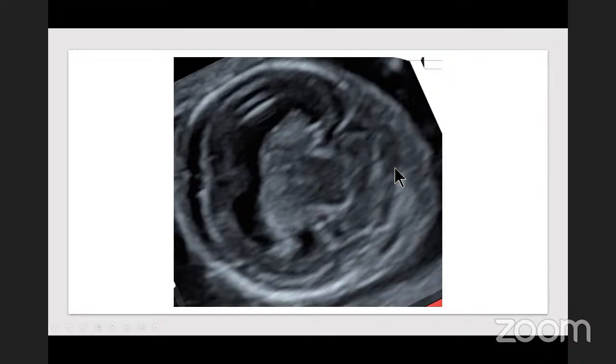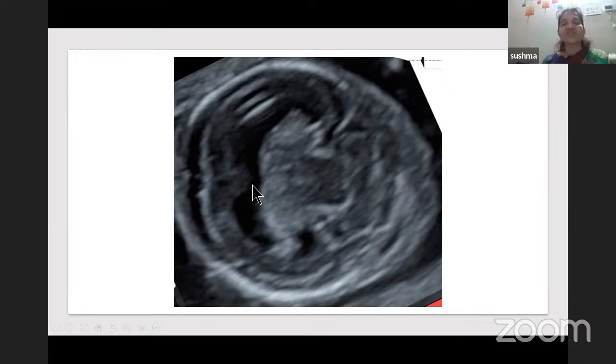Holoprosencephaly. Yes. By Dr. Alka Patil and Dr. Mallika Sunil Joshi also, same answer, ma'am. Okay, thank you very much. So the midline structure itself is absent here. Why do you think the falx is absent?